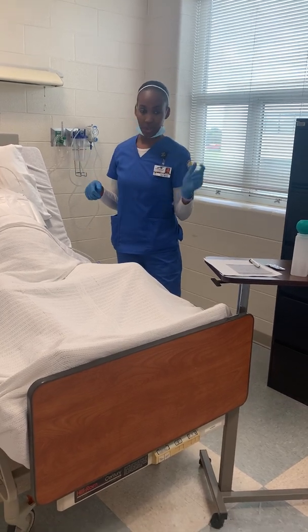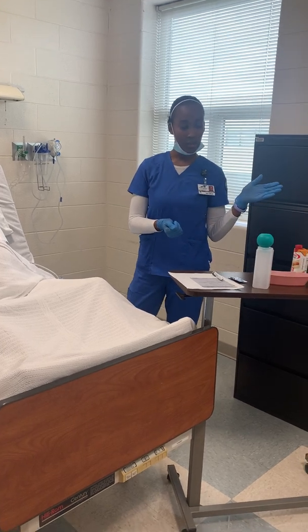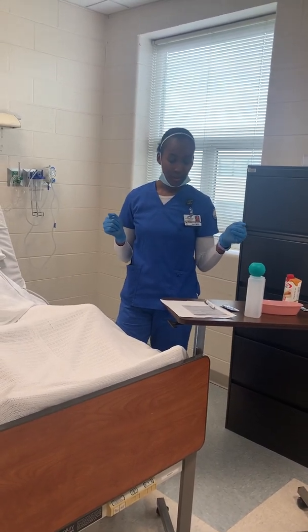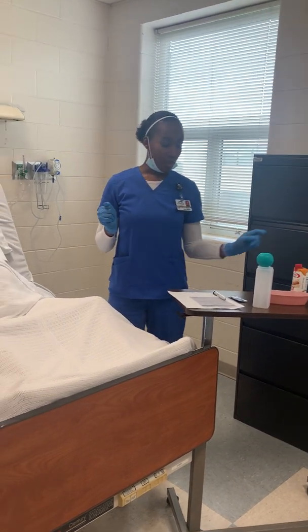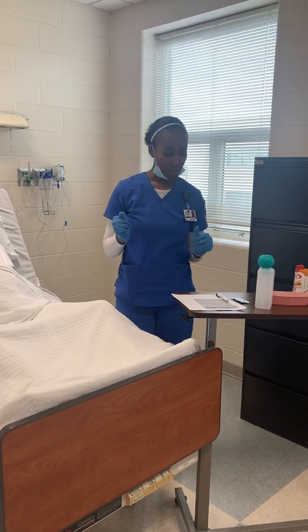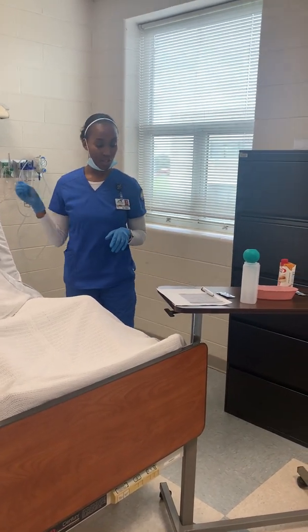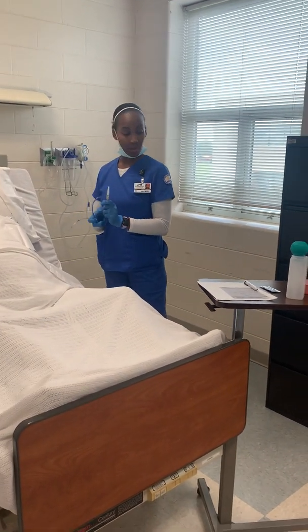And after I did the lavage, I'm going to take my contents and assess it and measure and document what I did. Okay, after the lavage, I'm going to go ahead and administer her Lucerna, her doctor's order. She is getting 100 milliliters with a 50 milliliter flush. So I'm going to unclamp her.